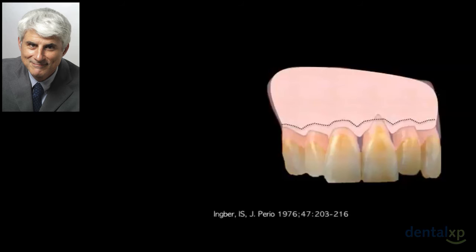On the other side, there is something else to observe. Every time we see a patient and we have to place an implant, we are always evaluating the bone on the buccal side. And how are we able to evaluate the bone on the buccal side? Of course, with a probe, we can sound the bone. And we know that to place an implant in a safe way, we need 3 millimeters of bone in the mid-buccal facial area, and 4.5 to 5 millimeters interproximally.